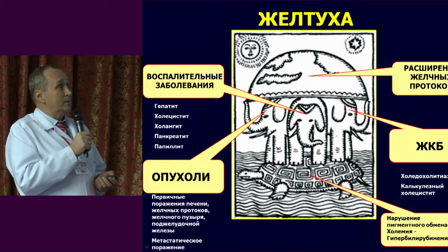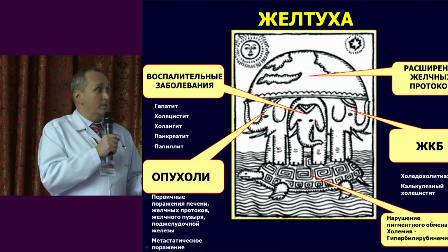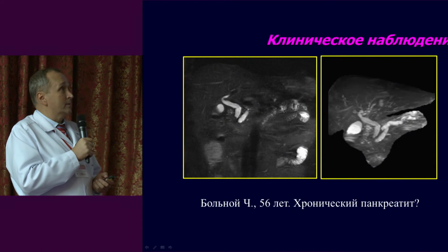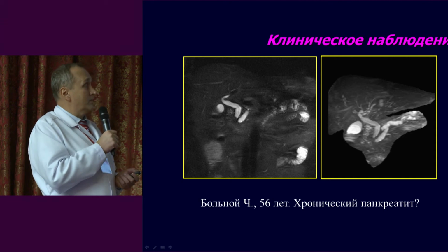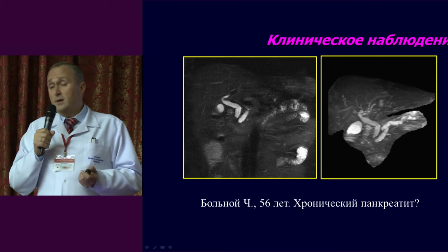It could be this or that type of reasons of bile tract dilatation also. And one of the most severe situations is associated with the tumors. And I would like to show you MRI cholangiopancreatography.